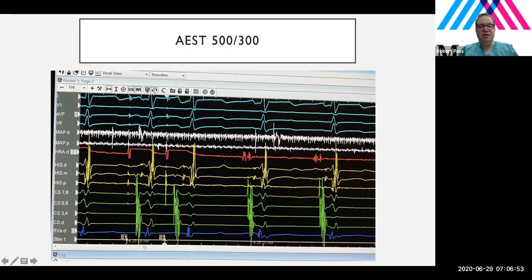You also may notice that the interval between the pacing spike and the actual atrial depolarization is also longer if you compare this interval from here to here versus here to here, and that's because as we get more premature, there's also decremental conduction within the atrium itself. All tissues are decremental to some degree. And so as we get more and more premature, the stimulus to A interval will also lengthen.